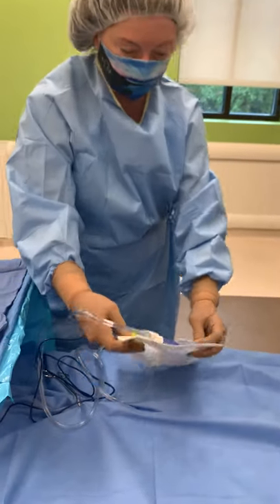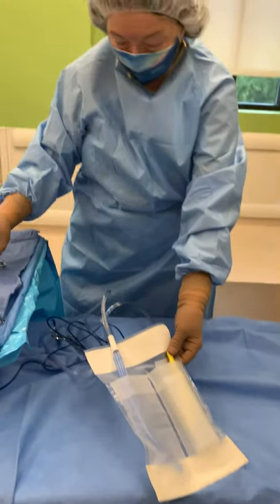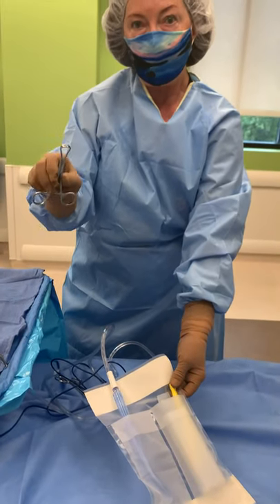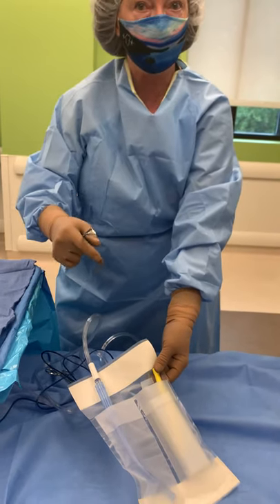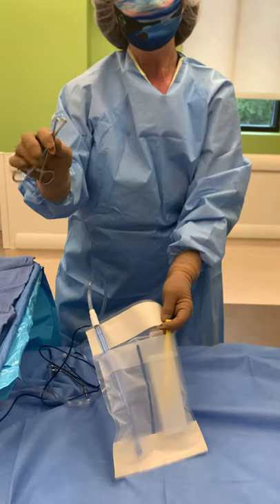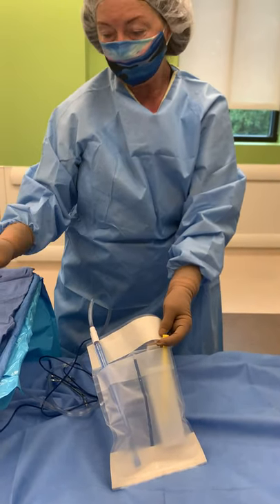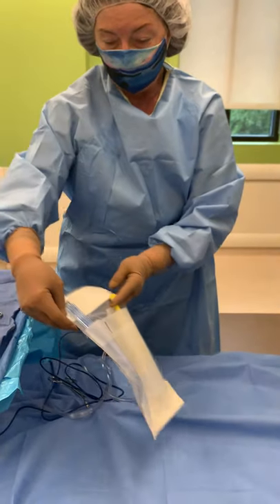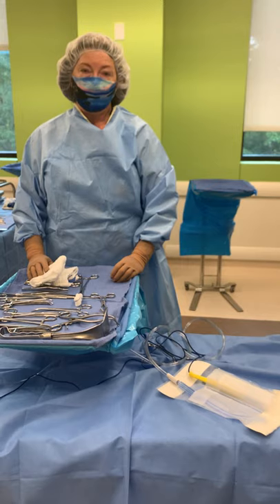This is a good way of securing the bovie and suction on your field without using a non-perforating towel clip to secure it to the drape. So it's either/or — you're either going to use this instrument pouch or you're going to use a non-perforating towel clip to affix it the way I previously demonstrated. And that is how to throw off your bovie and then your suction.